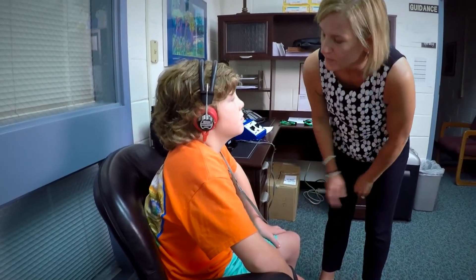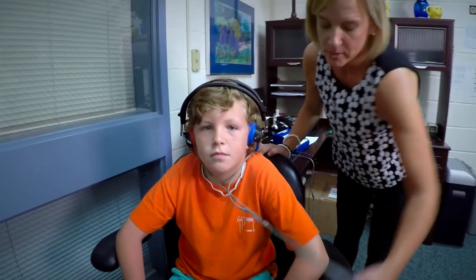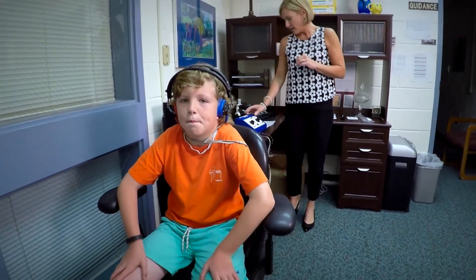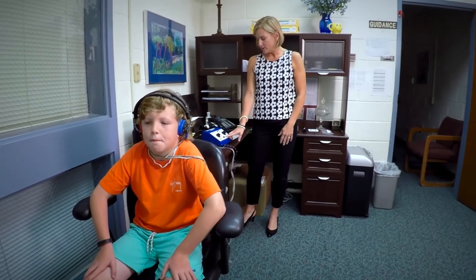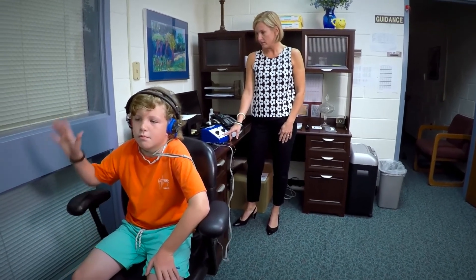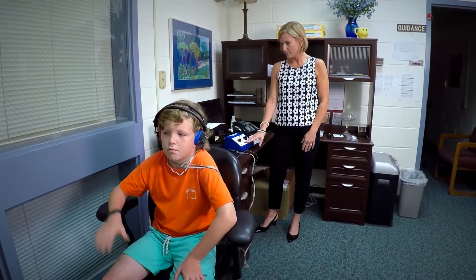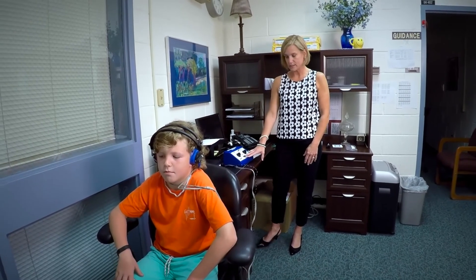Ask if it feels comfortable, and then face the student away from the machine so they're not seeing you present the tone. Then start at the 1000 frequency and push the tone button and wait for the student to respond by raising their hand. Then change to the next frequency of 2000 and then the next frequency of 4000.